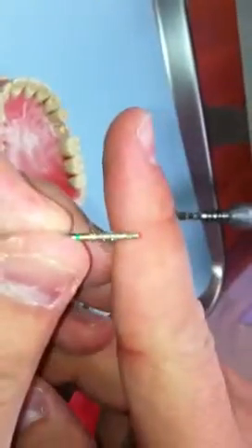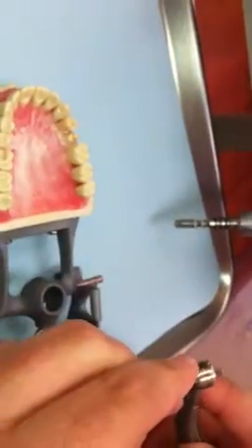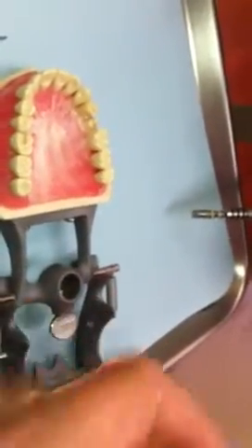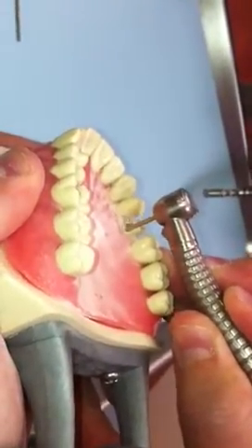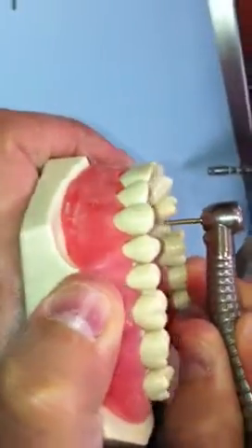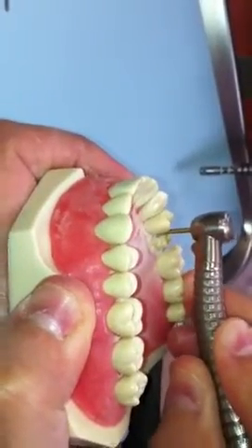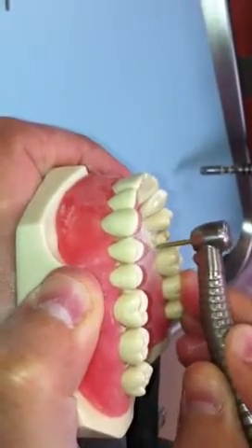Take our shoulder burr — you can see it's flat on top. One millimeter. The proximal: one millimeter, one millimeter.